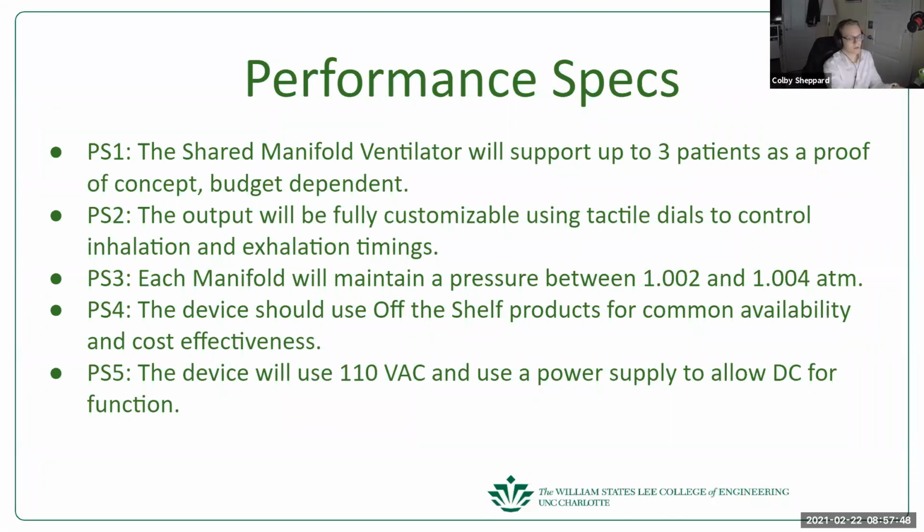Yeah, well, 50 hertz versus 60 hertz isn't any problem. But ideally, when you're picking that DC power source, it should be applicable across the range of AC voltages that are applicable in the world.